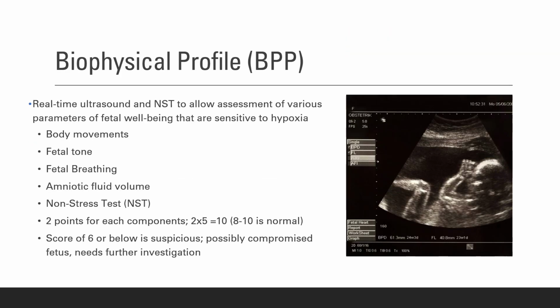If an NST is negative, if an NST is not reassuring, we normally have to do further testing, which we call a biophysical profile, a BPP. This is where the doctors, the midwife, and/or nurses that are certified take an ultrasound.